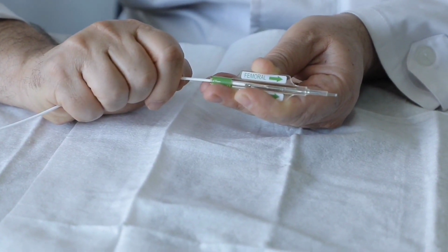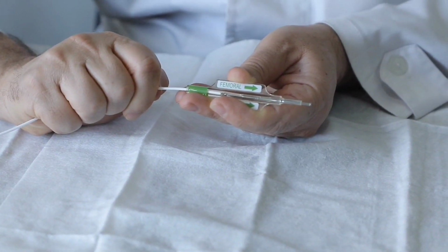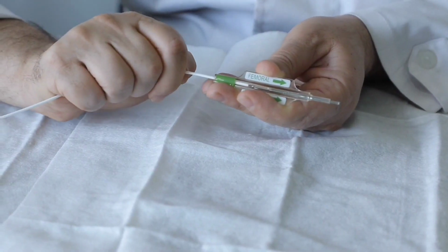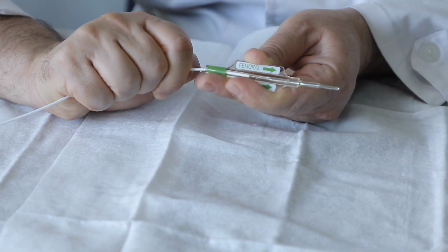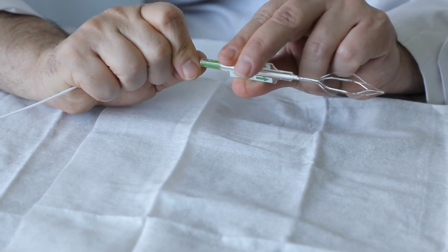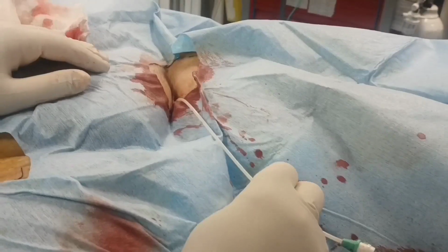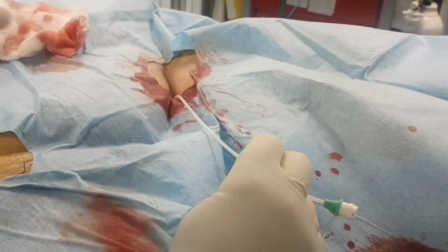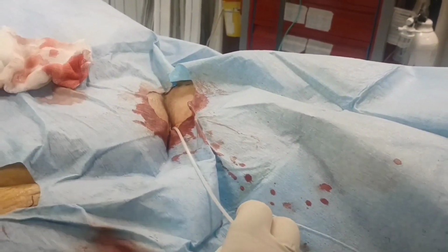As you saw, the tip of the IVC filter emerged, and usually once we see the tip of the IVC filter under fluoroscopy, we need to perform the remaining steps unsheathed. This means that we no longer push the delivery system forward. Instead, we pull the sheath back. By pulling the sheath back, the IVC filter is released. And this is the moment when the IVC filter is deployed. At the final stage of the procedure, after we have successfully deployed the IVC filter, we remove the sheath and, with slight pressure, hemostasis will be achieved.